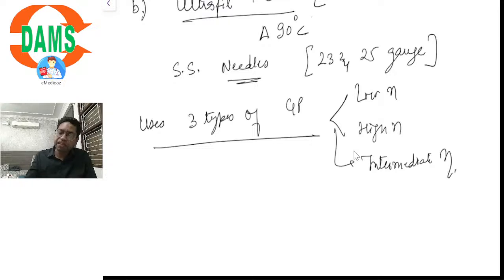But what you have to remember is that it is a low heat technique because the heating temperature of gutta-percha is 90 degrees Celsius. We heat it to 90 degrees and inject the gutta-percha directly in liquid form. That's why it is called the thermoplasticized method.